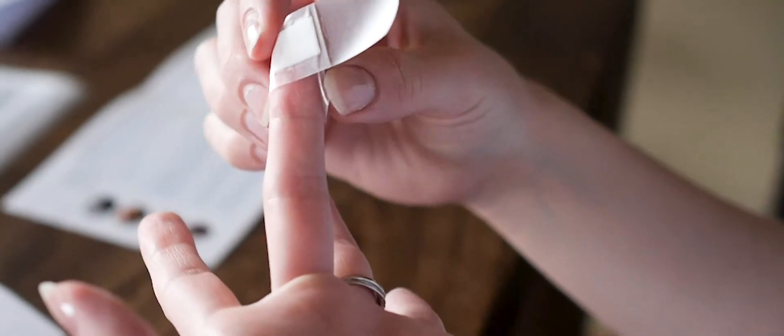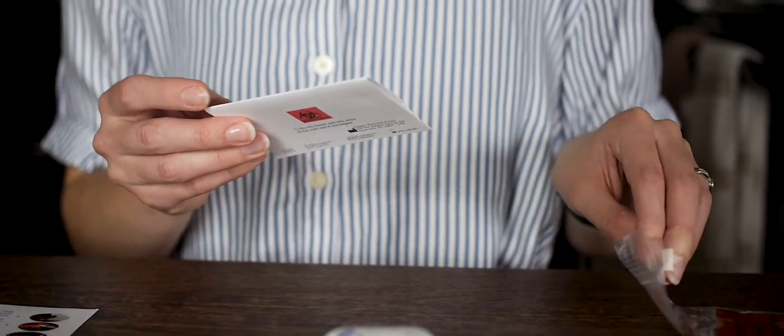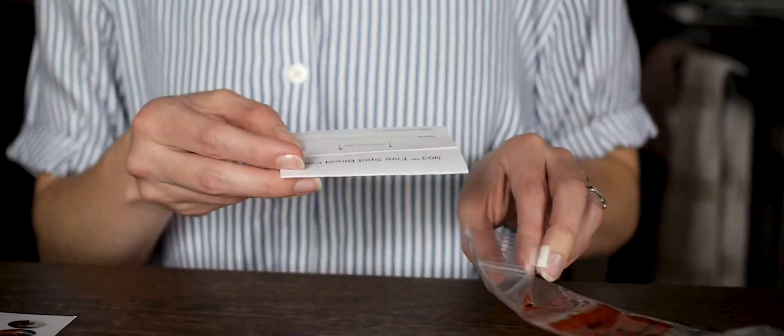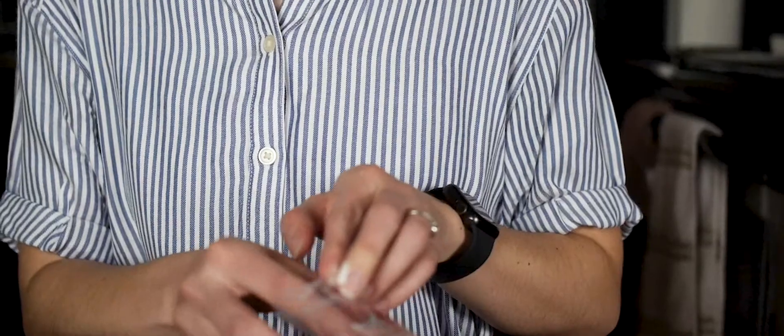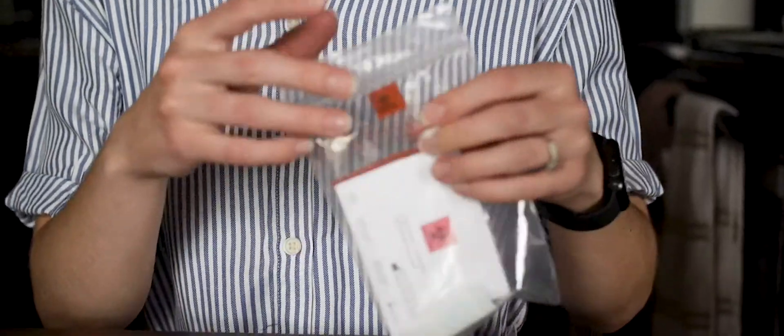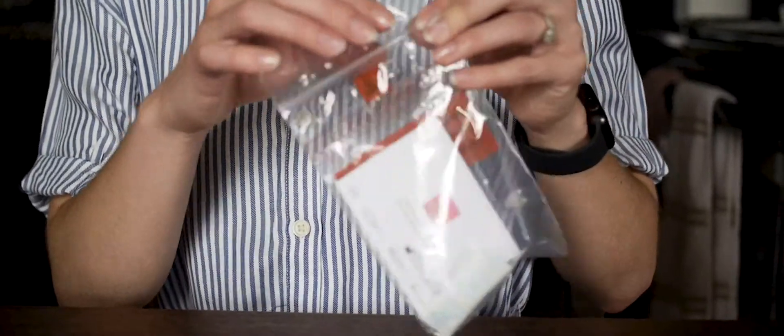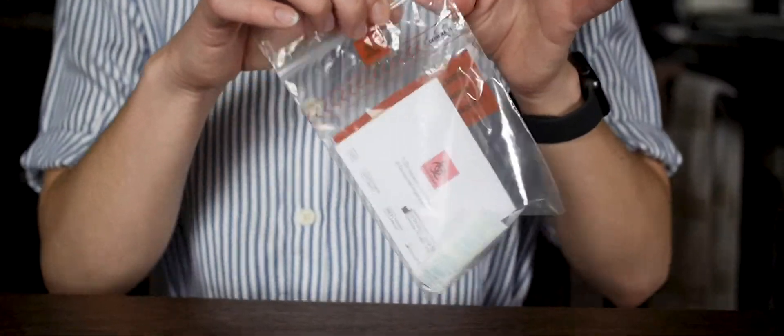Step 5. When done, gently wipe off excess blood with the cotton gauze and wrap your finger with a band-aid. Leave the blood spot card open for at least 30 minutes. After it's dry, close the flap and place it into the provided biohazard plastic bag. Store in a cool, dry place until you are ready to mail.